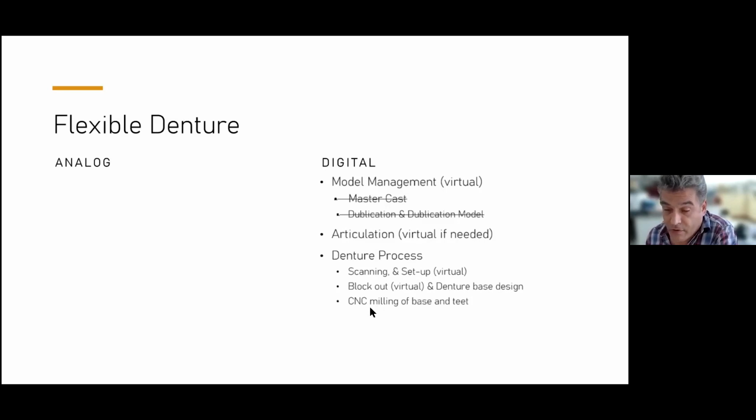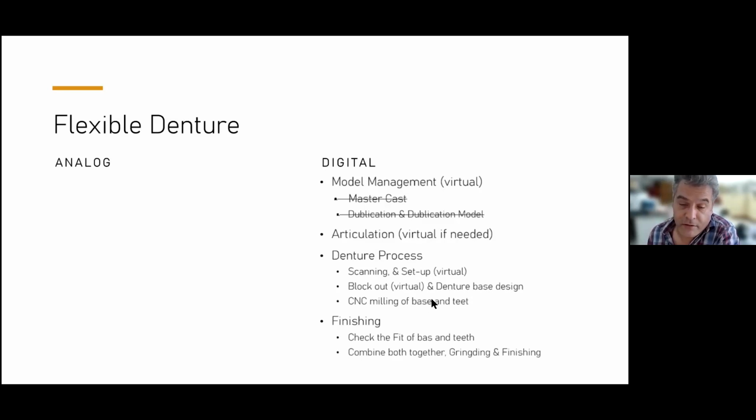I use CNC milling for the base and the teeth, and also you can, of course, print nowadays the base and the teeth maybe also. And after, you just need to check the fit of the base and the teeth, and you combine everything together.